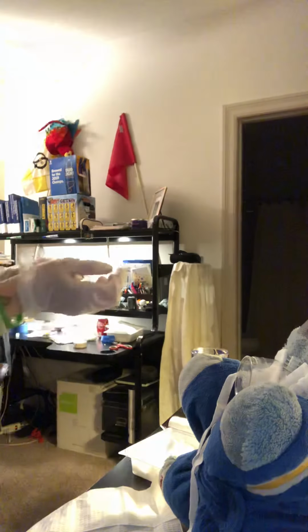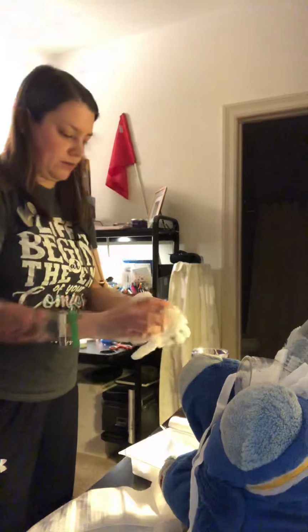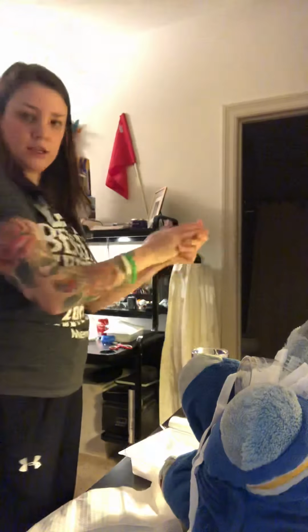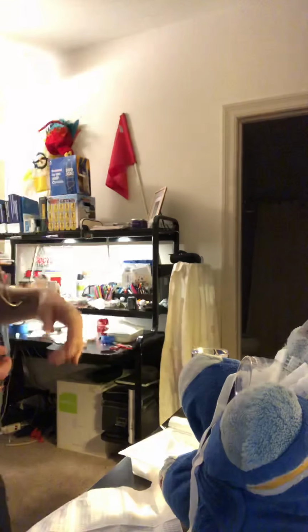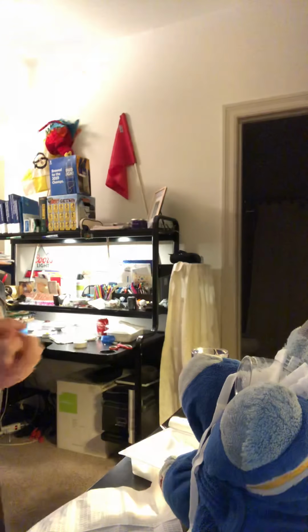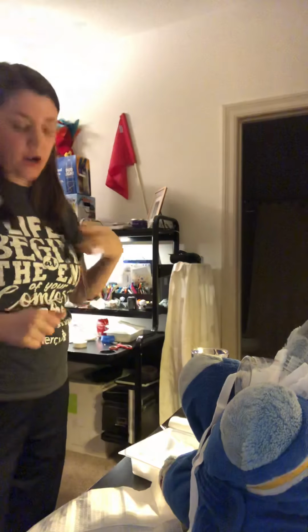Okay, after that I would go ahead and take off all my stuff. I don't need all this stuff on anymore. And we'll perform hand hygiene. So then now I will make sure I put the side rail back up and everything. I will make sure the bed is in the lowest position and locked, the call light is within reach, and then I will perform hand hygiene again before exiting the room.